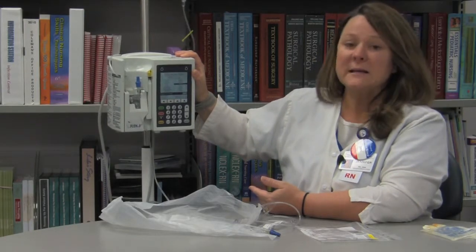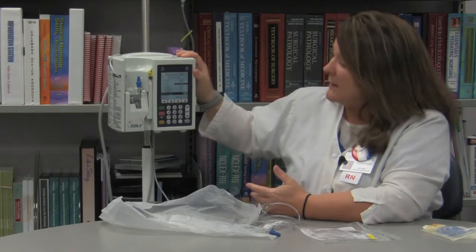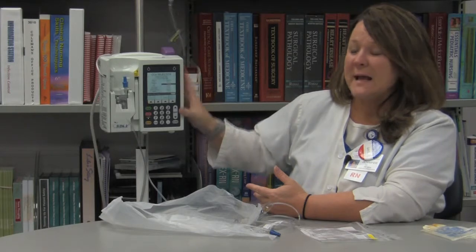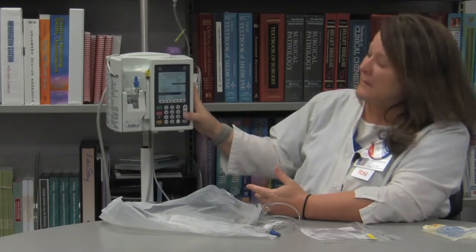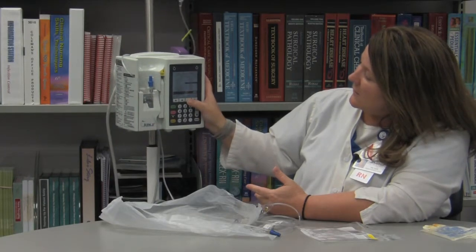What that means is basically where you're working. Are you working on 3 North? Then you want to be sure that you plug in 3 North for your CCA. All right, but to do that, you just move your arrows up and down till you find 3 North. Once you do, you hit enter.